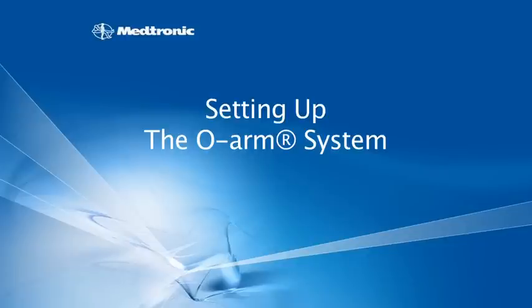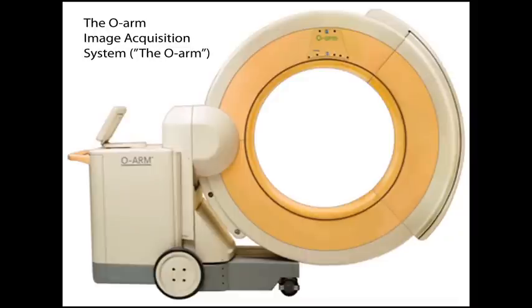Let's look at bringing the OARM system into the operating room. The first step is to turn on the OARM image acquisition system, commonly called the OARM.